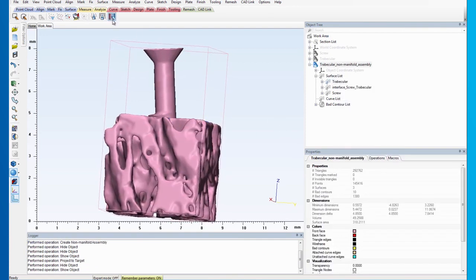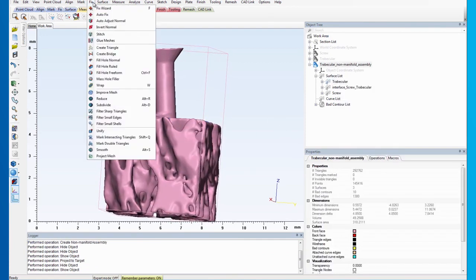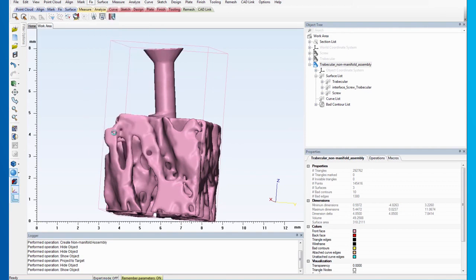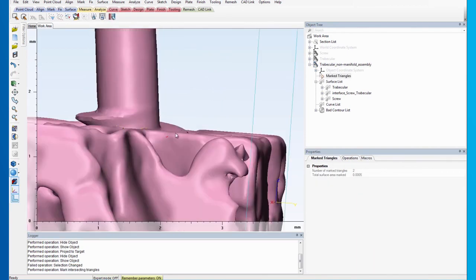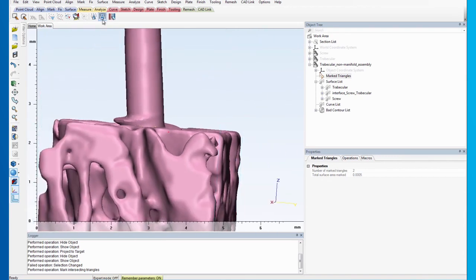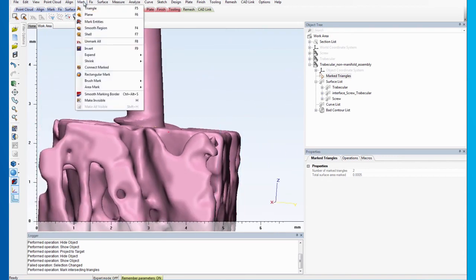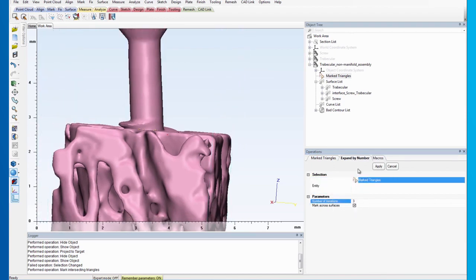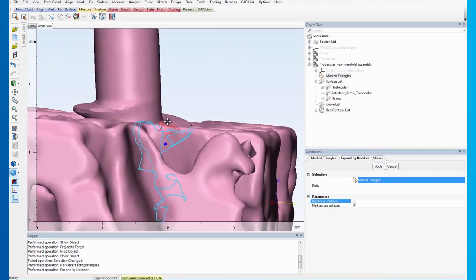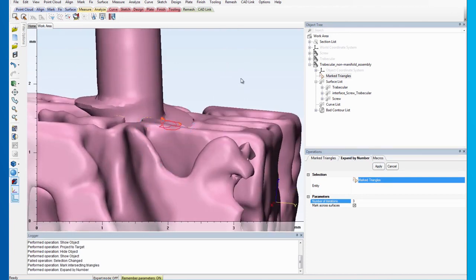Then, go to the Fix menu and select Mark Intersecting Triangles. To expand the marked areas, go to the Mark menu and click on Expand by Number. Select the marked triangles as the entity and set the number of iterations to 3. Click on Apply.